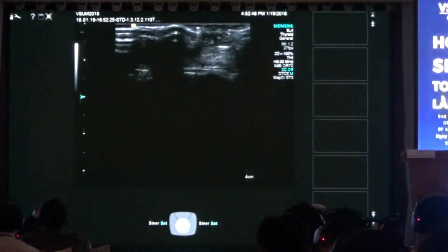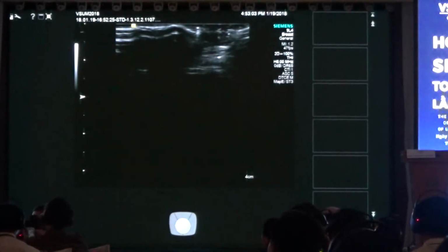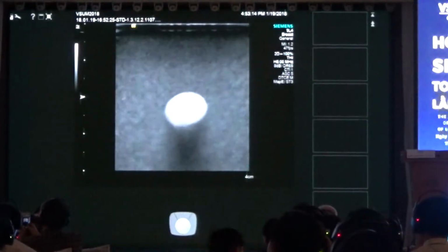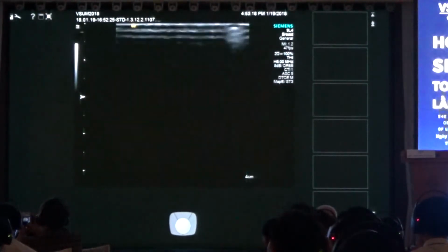So we rotate the breast patient and try to get the breast in the area we're concerned as flat as possible. So we rotate the patients a lot. Usually if it's in the medial portion of the breast, supine is okay. But if the lesion is lateral, we have to rotate the patient up and try to get the breast as flat as possible. Because if you try to put pressure here, just like we've talked all along, if you've got an organ, I'm putting much more pressure in the middle where the transducer is and much less on the end.